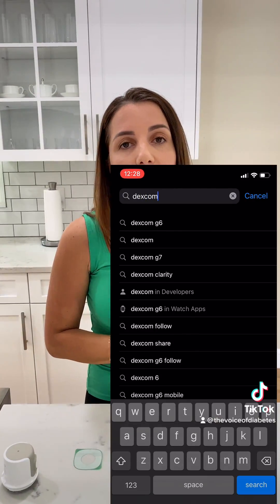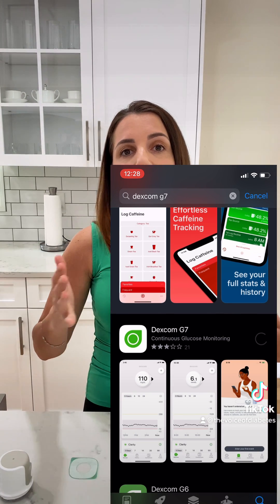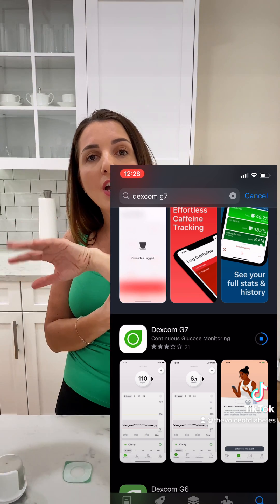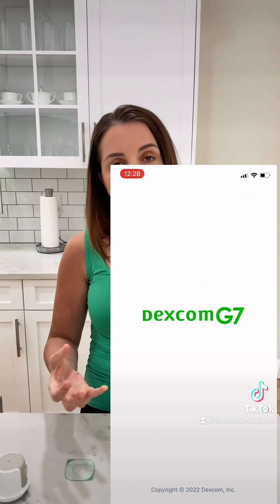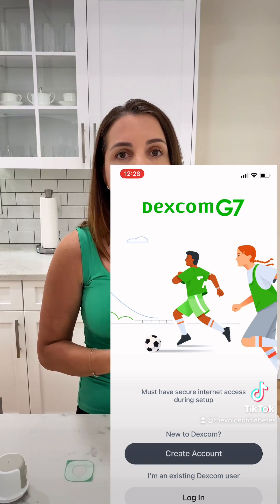I'm going to go onto my iPhone and upload the G7 app, which I'll demonstrate. While I'm putting in the information for the G7, the sensor is already starting to work, so by the time I'm done uploading the app I might only have 20 minutes left of warm-up time. You don't have to upload the app first — you can put the sensor on and then upload the app, or upload the app and then insert the sensor.